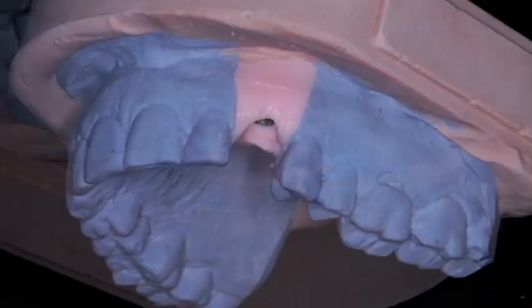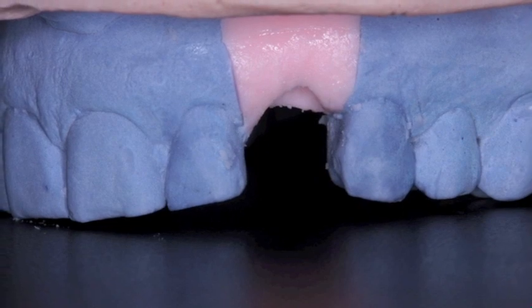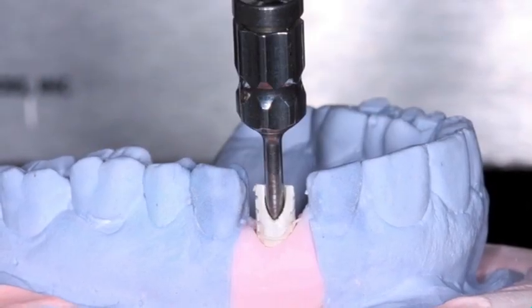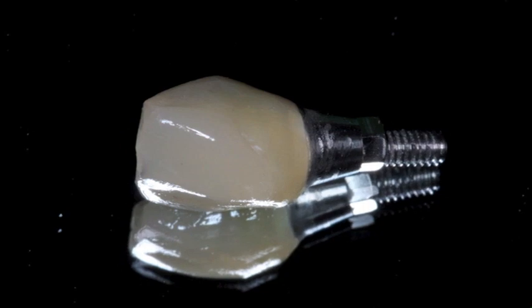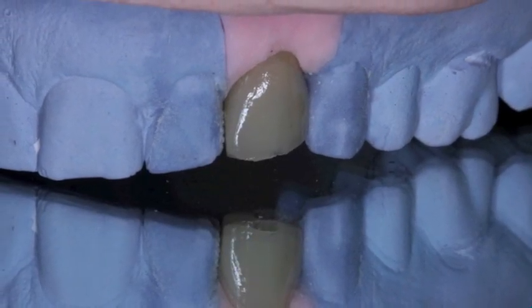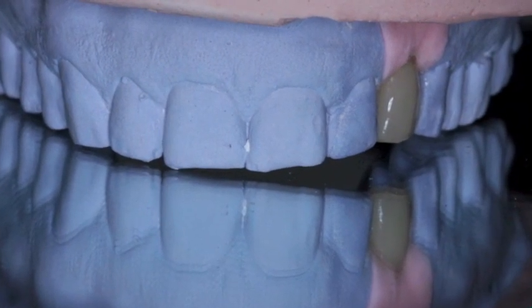With this silicone in place, we can actually contour the tissue, simulate the surgery entirely before it's done, create proper aesthetics and emergence profile. At this point, we can actually fabricate the prosthesis, whether it's a temporary or the final. In this case, we chose to do a temporary abutment with a provisional material. Here's the provisional itself. It's a screw-retained prosthesis. This will be placed the day of surgery. So without further ado, let us begin the surgery.